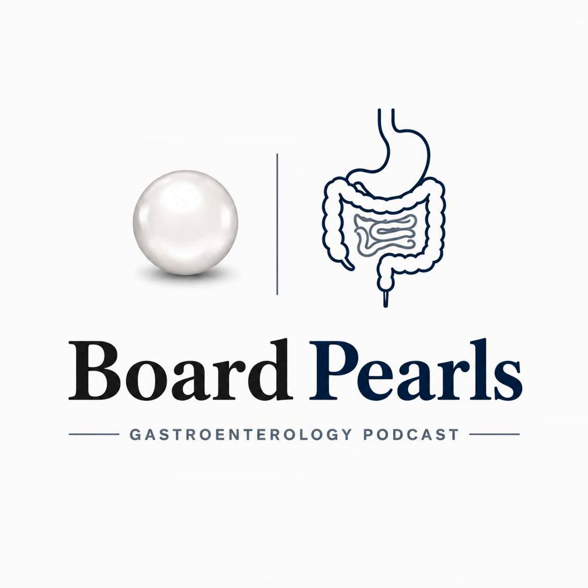Paris 0-IIc and the mixed 0-IIa plus c carry disproportionately high rates of submucosal invasion, and the reason is the one we just named. A depression on the surface is what vertical growth into the submucosa looks like from above. The lesion has pulled down into the wall rather than out into the lumen. By the time you can see the depression, the path to deep invasion has already started. So a flat elevated lesion with a central depression is not a piecemeal EMR target. The next move is en bloc resection or surgical referral.